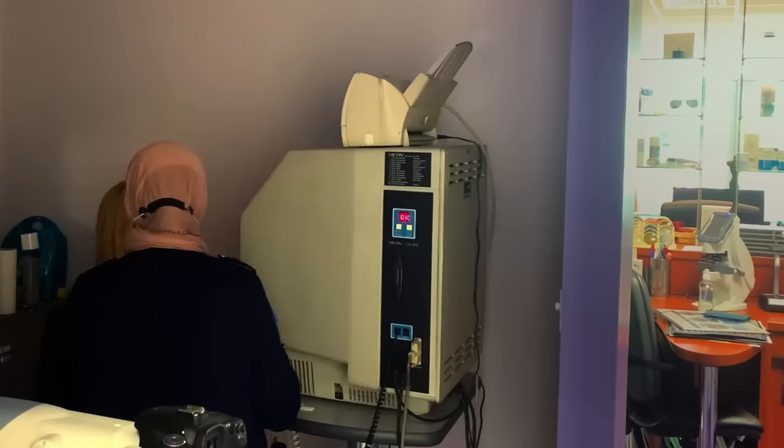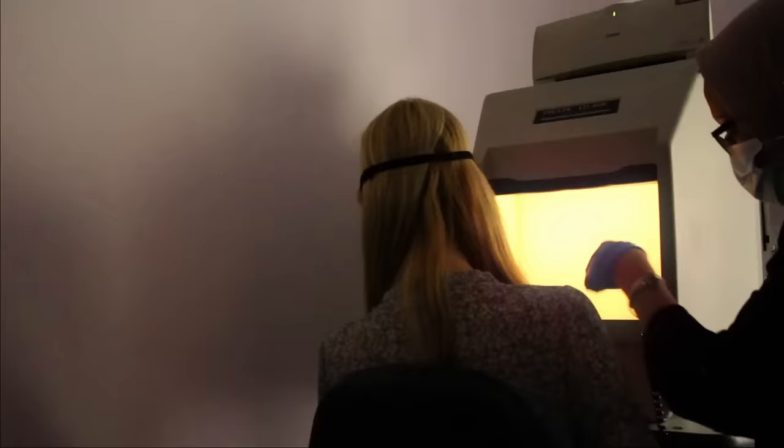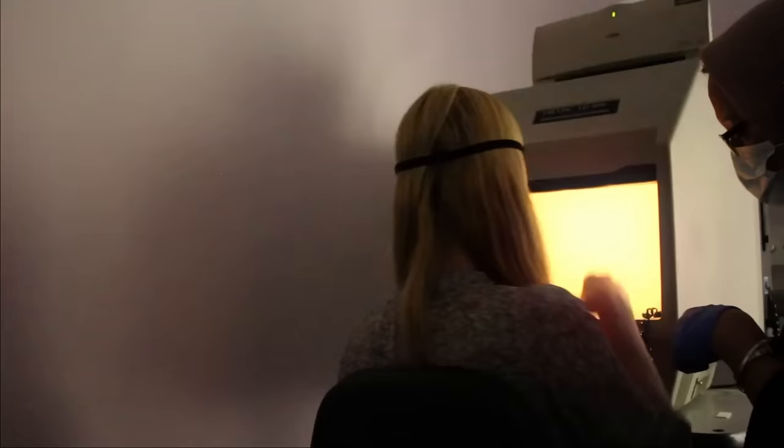So what I'm going to do now is just pop this over your left eye, like a pirate patch. Is that okay? This is your button. If you grab it yourself, can you see there's a blue at the top here? There's a button there. That's your button. Can you see that red light at the moment?